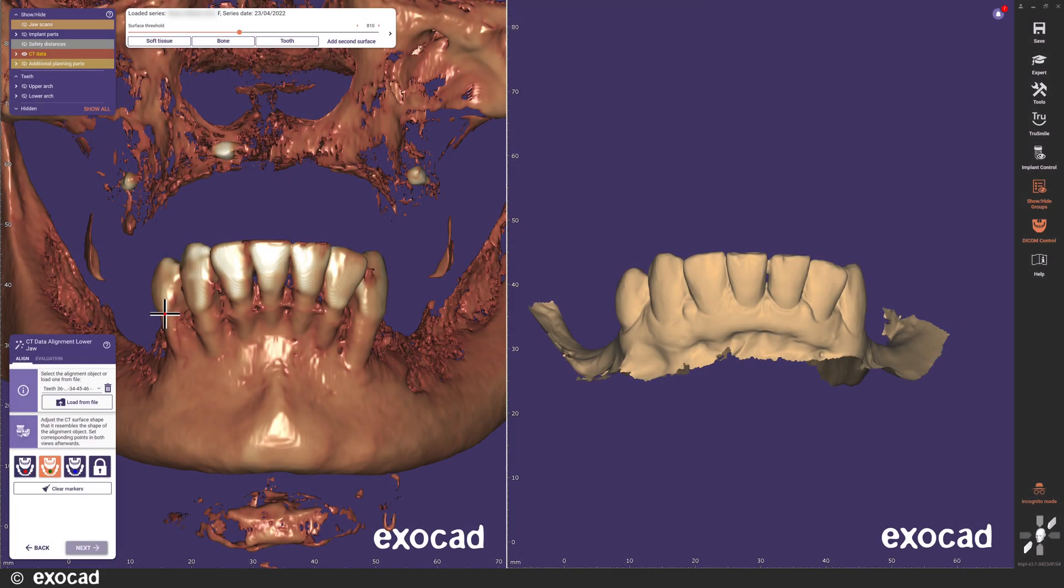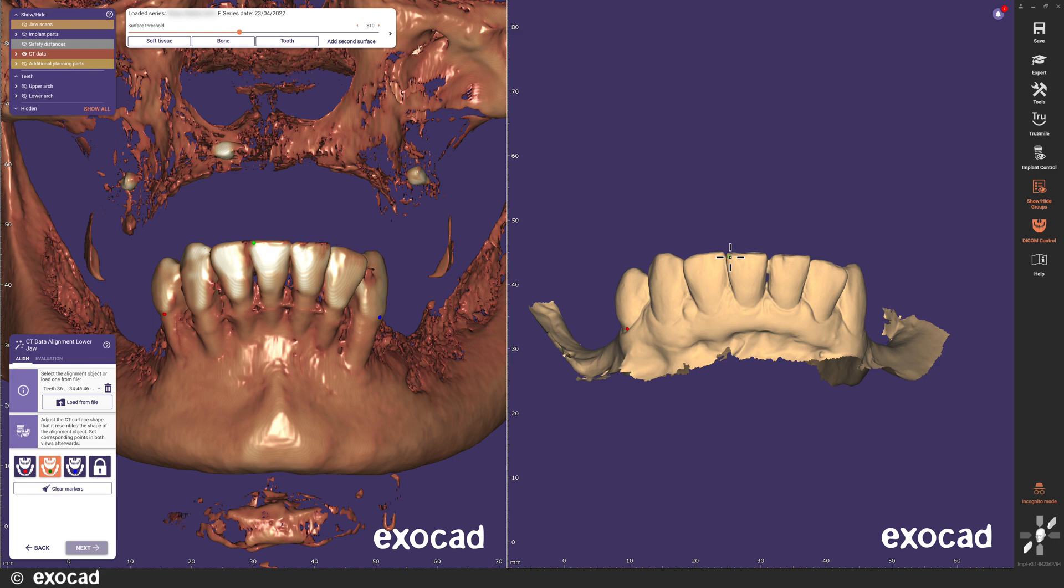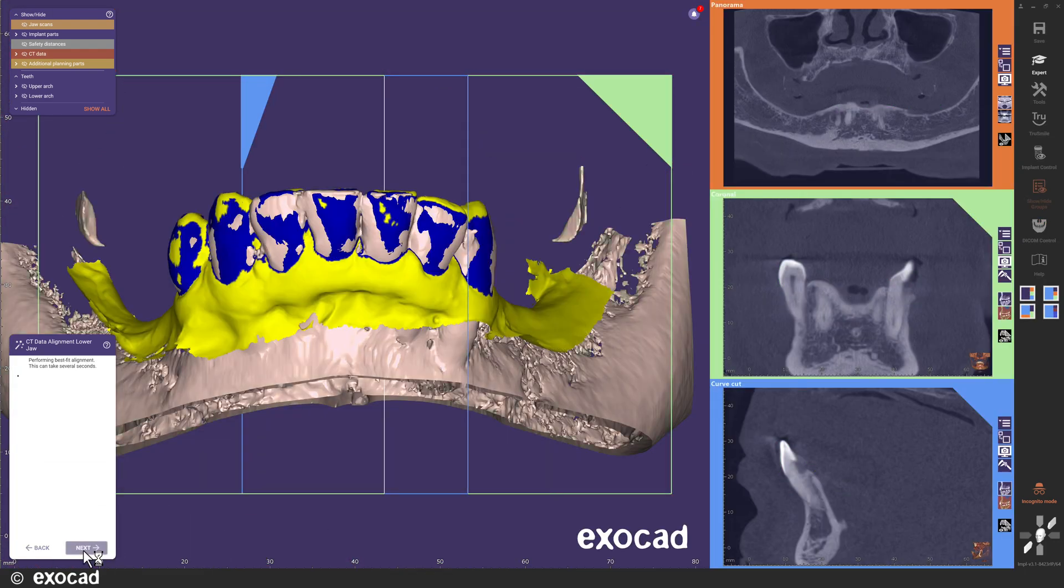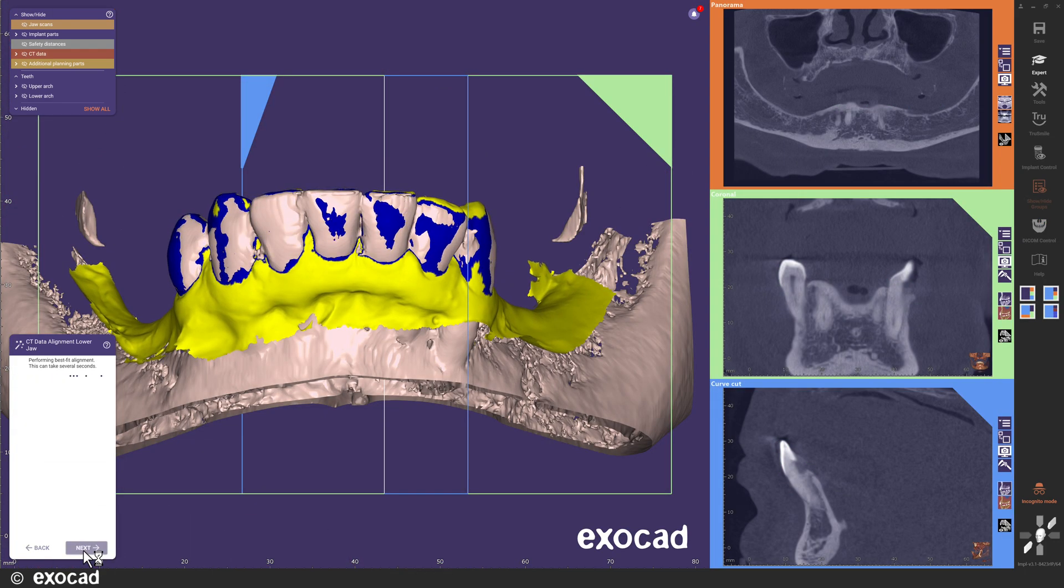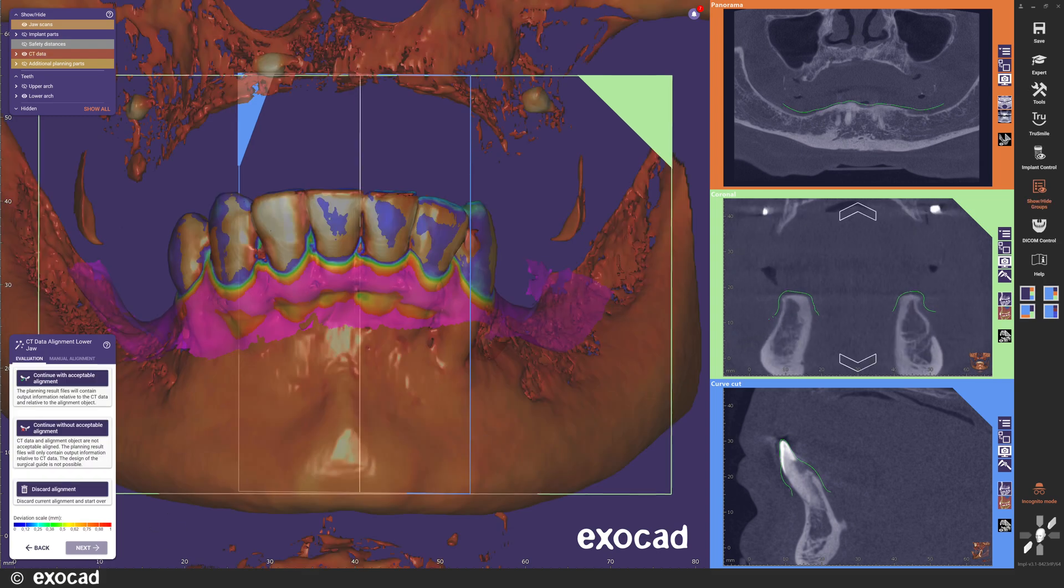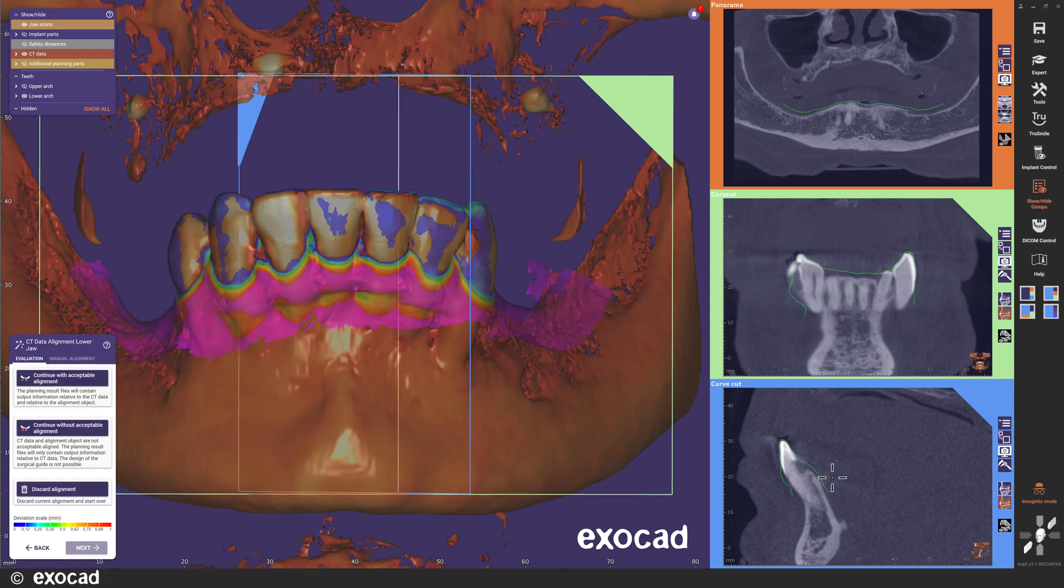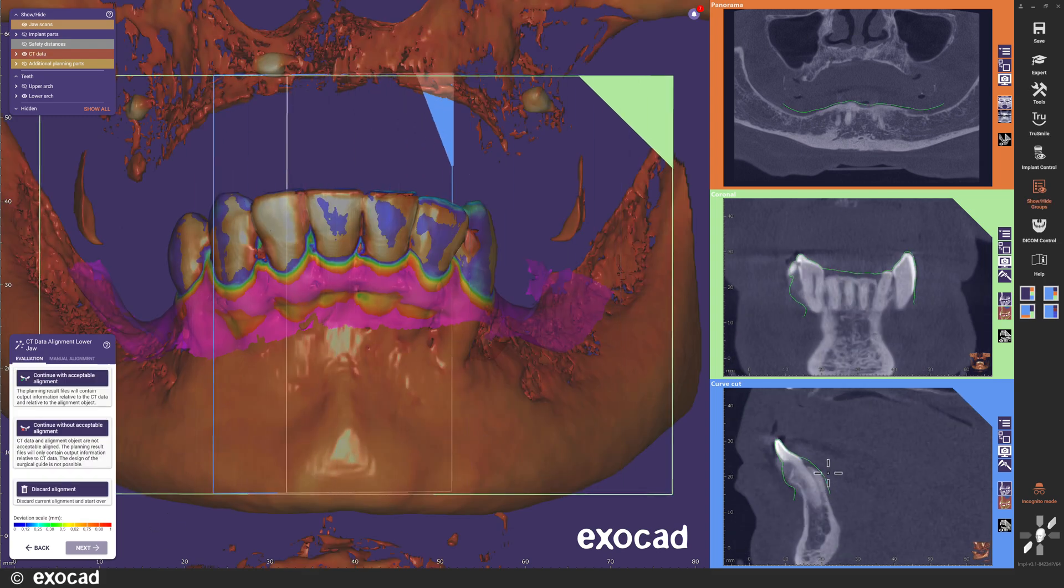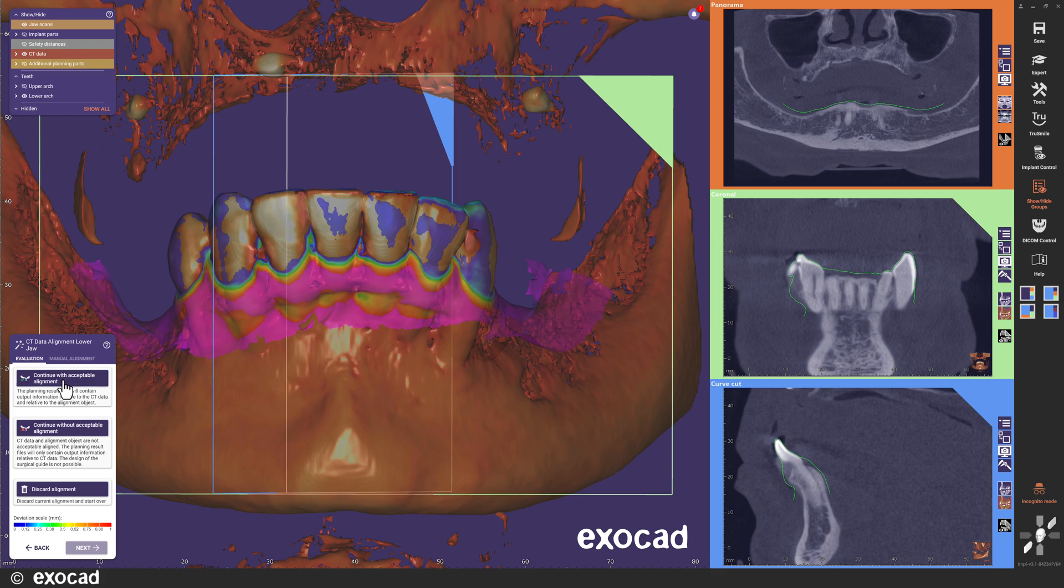First, I perform the CT to mesh alignment for the lower jaw. In this version, you can place the points first in one view and then the other if you prefer. I start the best fit alignment by clicking next and after checking the alignment, I continue by confirming the alignment as acceptable.